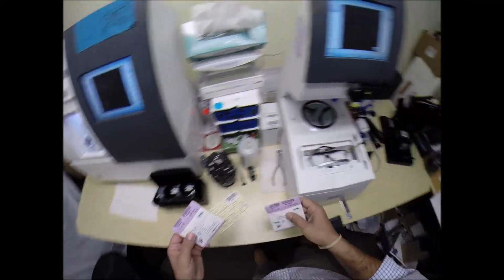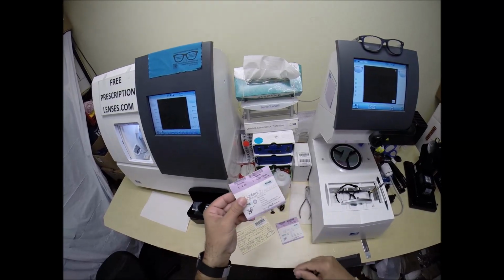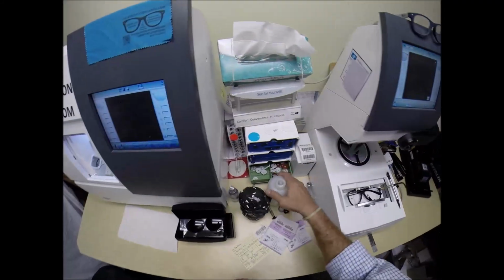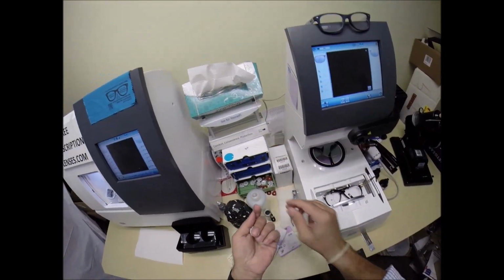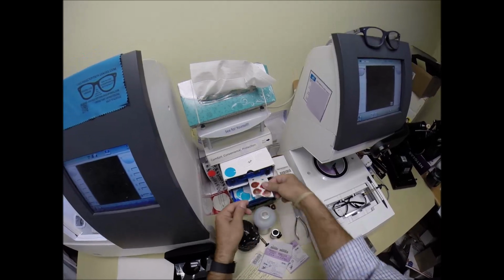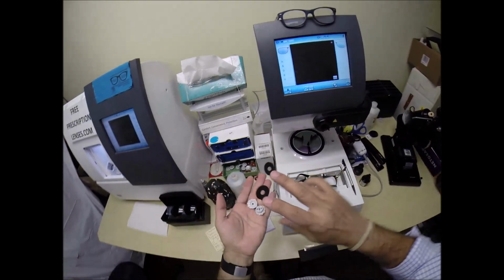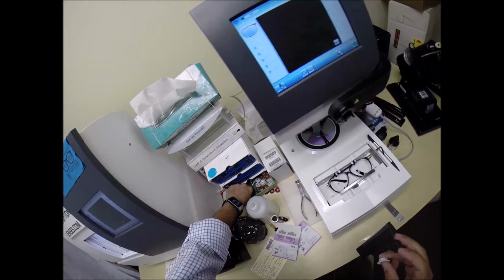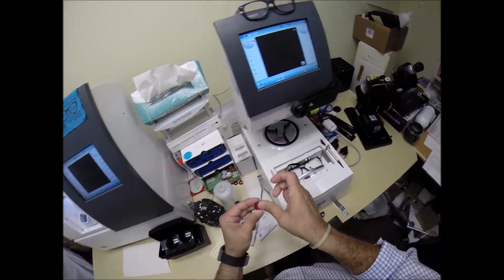So normally in prescription, I would get these dotted up ready to go, but because these are non-prescription, I'm just going to take them out of the packet, put it onto the platform. Now this is a block, or as I like to call them, Jenny from the block. I need to attach these to your lens while it is cutting, so I need two double-sided adhesive stickers, of which I've got a couple right there. The black side is the sticky side. All right, next one. And stick one onto the first one.